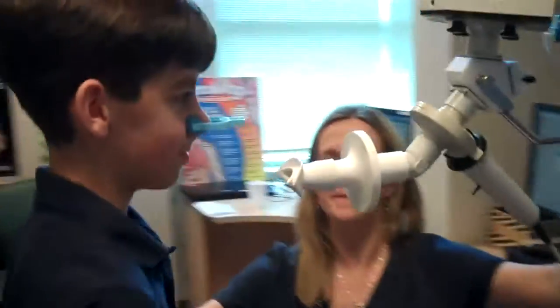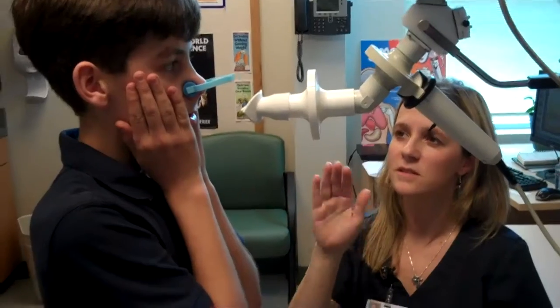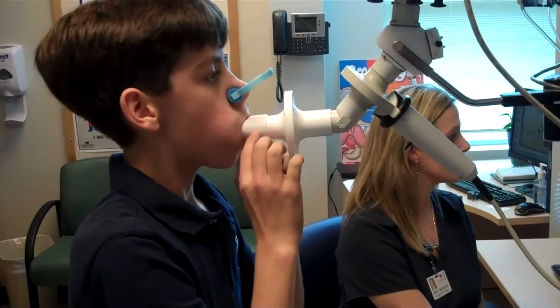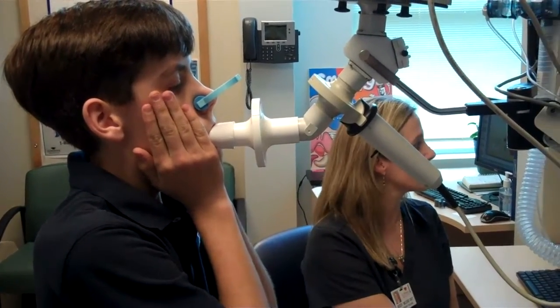Can you come stand over here? Now I want you to place your hands on your cheeks and just breathe in and out nice and easy. Just very gentle. Go ahead and get your mouth on the mouthpiece. Put your hands up on your cheeks and just relax — just breathe in and out.